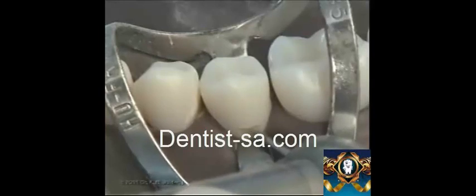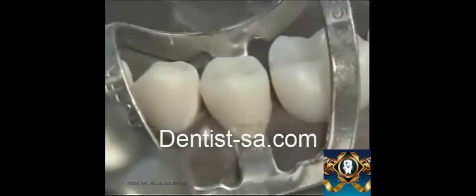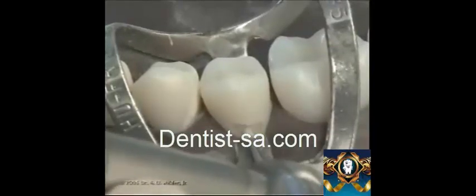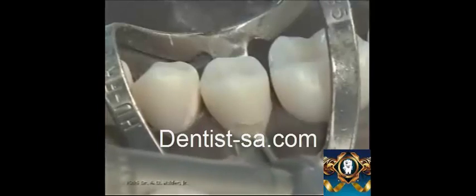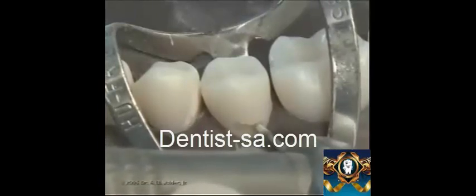The preparation depth into the dentine will be 0.2 mm in the crown portion and 0.5 to 0.75 mm into dentine in the root portion, if the cavity margins are on the root surface. This preparation example is a conventional Class 5 composite preparation design, which requires a specific axial depth and line angle forms, as an amalgam restoration.